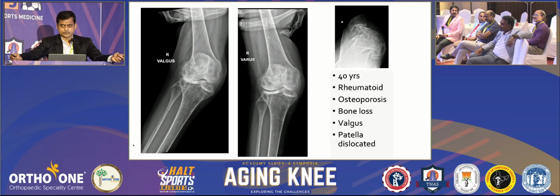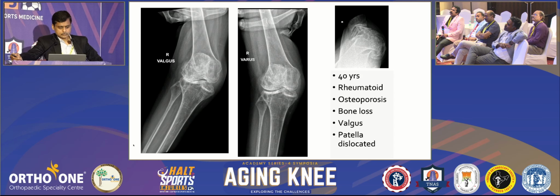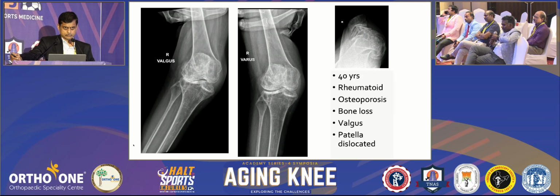Yeah, Anup? So we do bone density in all our cases, but this patient definitely we should do a bone density. In case we are adding a stem on the femur, it has to be a short stem because a long stem will go very near the total hip implant. Wherever we have a total hip up there, we should use a short cemented stem, though I don't think it will be required. Rest is a standard correction of valgus knee. I would still choose a cruciate retaining or ultra congruent type to prevent a big box cut. Karthik, anything more you want to add? I would be happy doing a lateral approach and a routine knee, sir.